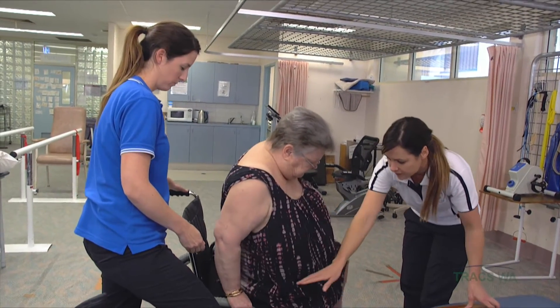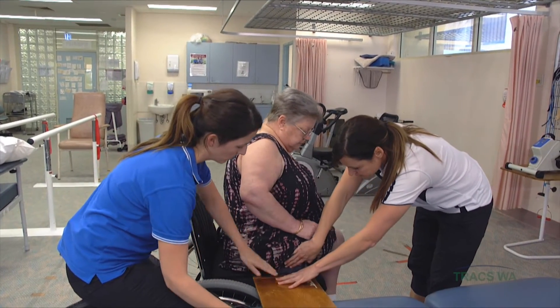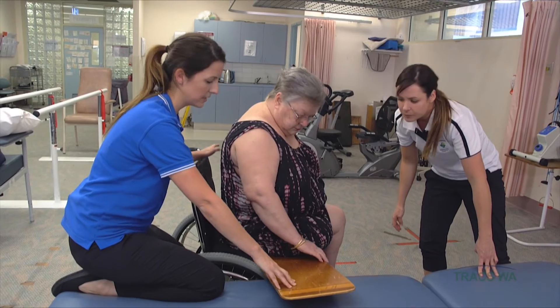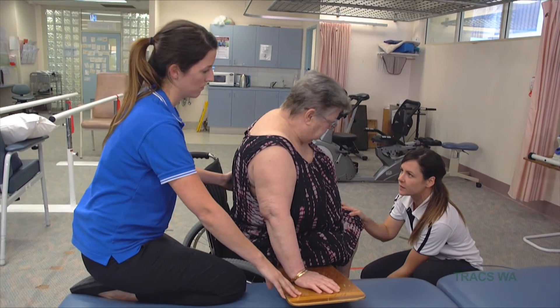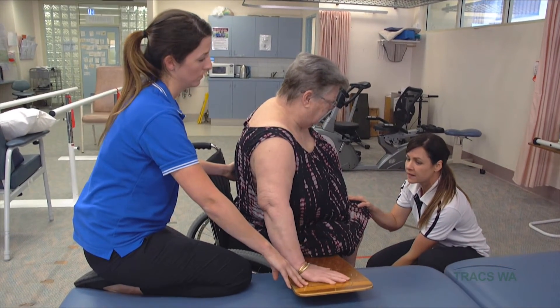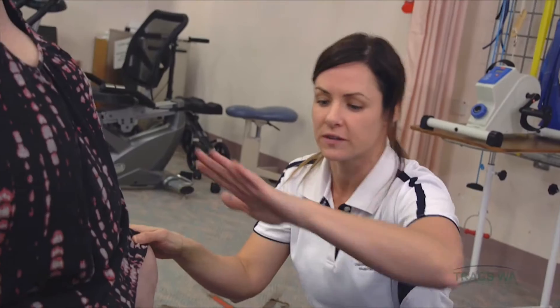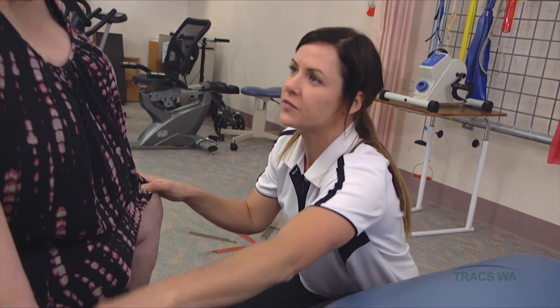Danny and I are both going to help — I'm going to be behind you and Danny's going to be in front. If you want to shuffle a little bit forward in the wheelchair, just leaning over to the side, I'm going to push that down into the cushion. We don't want to catch your skin there, so we want the board to be placed underneath nicely. Because your foot's a little bit numb, I'm going to support you through this leg, and Bridget's just going to help you lift your bottom across the board so that you don't slide. Try not to get your fingers underneath the board — it's a nice flat palm.